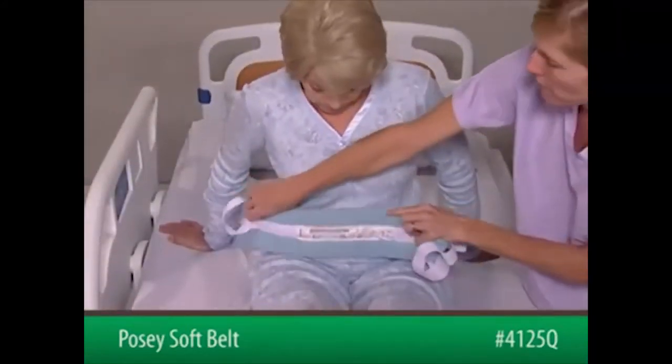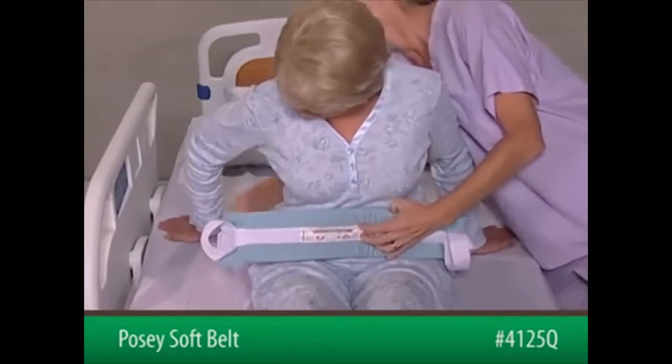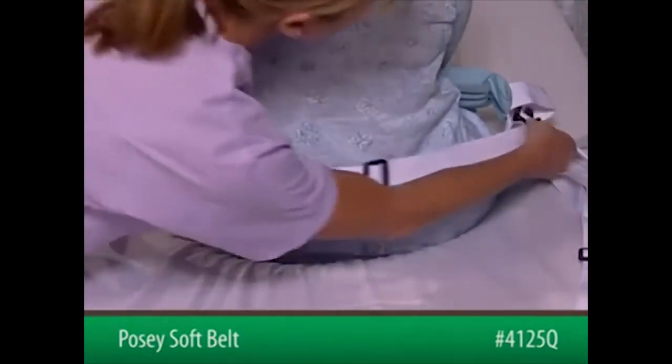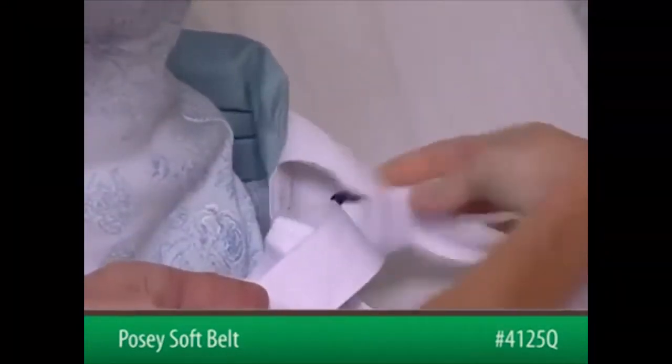Next, bring the belt around the patient's waist with the foam pad to the front of the patient and the label facing out. Cross the straps behind the patient and feed each strap through the positioning loops on the ends of the blue foam pad.